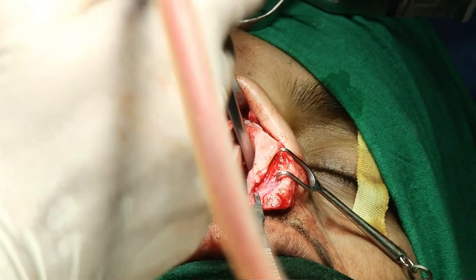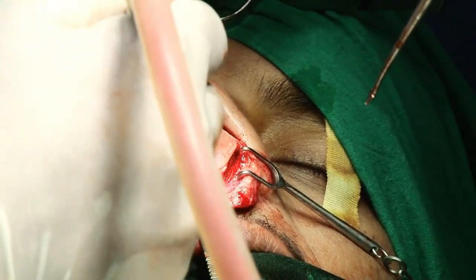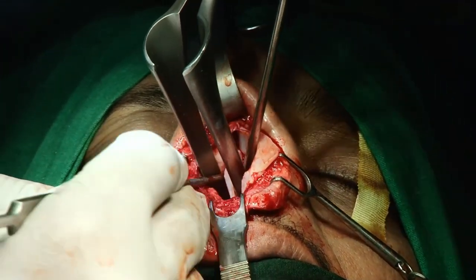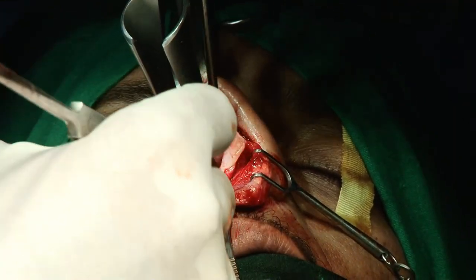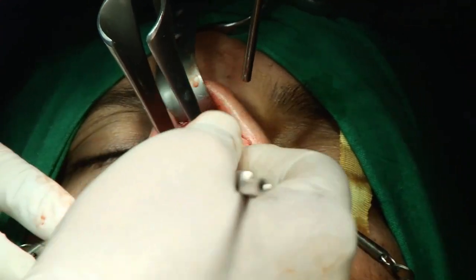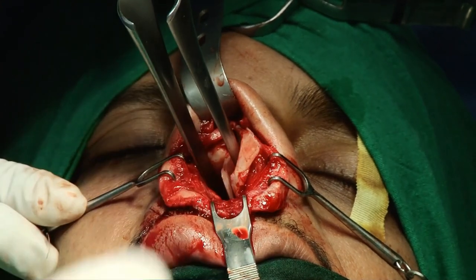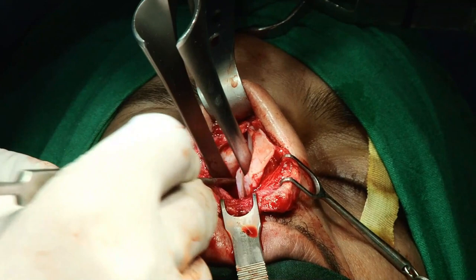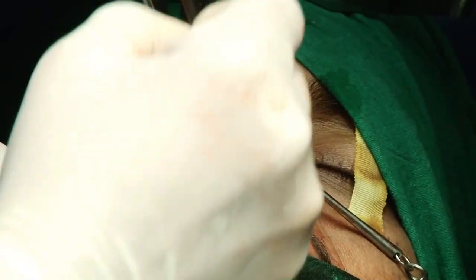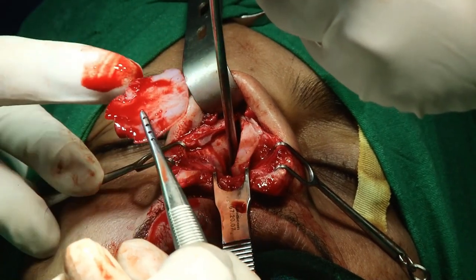Now give me suction. So one side I complete, both sides I complete my mucoperichondrium. Now I want to detach this septum from the rest of the attachment. Like this. Go posterior and run from the posterior to the anterior. We always try to harvest as big a piece of cartilage as possible. But you never pull unnecessarily on the septum, because sometimes if you pull it, it tears. I check where it still has attachment, so I just separate the septum. Now this is a very good process. So this is my septum, this is the superior attachment, this is the anterior attachment and this is the posterior attachment, this is the perpendicular plate.